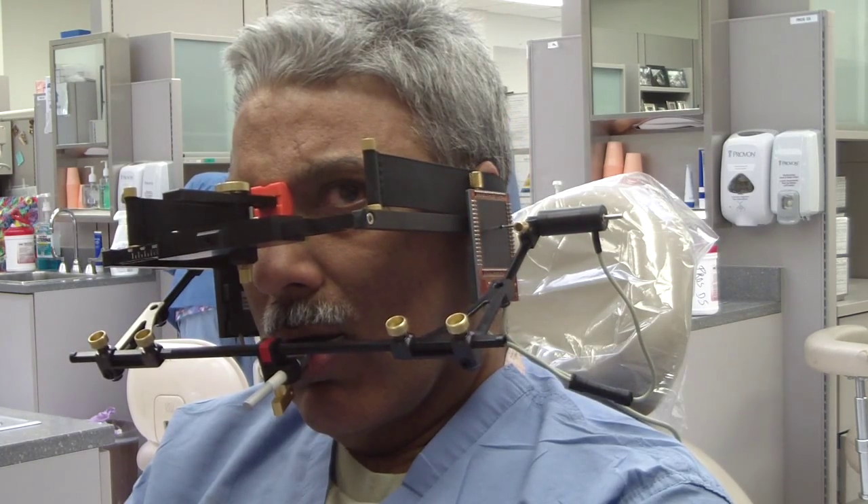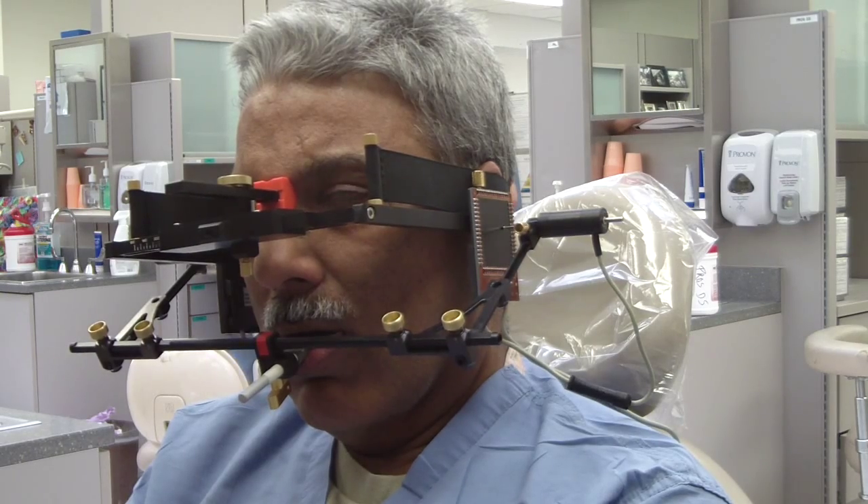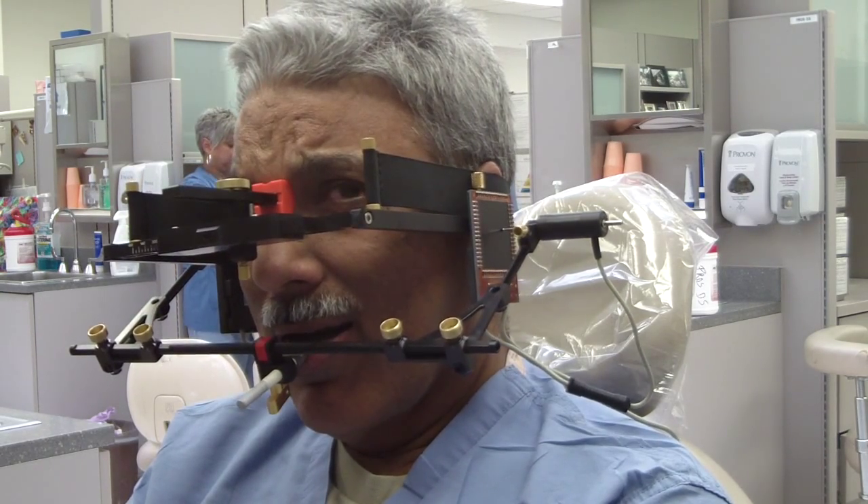This would be more relevant in a full mouth restoration, fixed restoration — not our full mouth removable prosthetic rehabs.